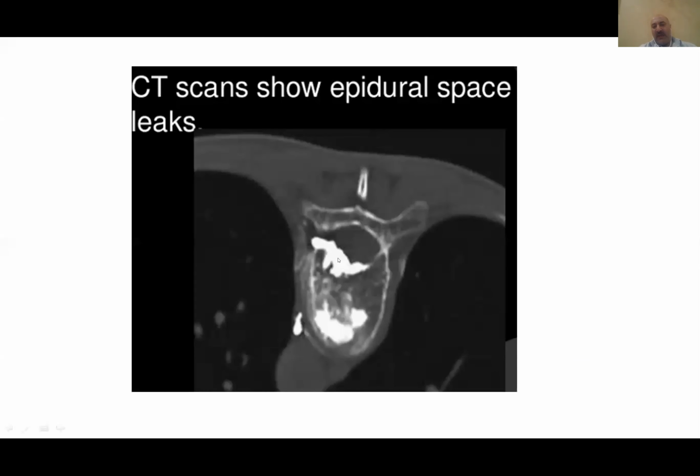As my colleague Khaled mentioned, nowadays, even if there is a fracture in the posterior wall, it's not an absolute contraindication. We can still operate if you follow the instructions, the ones we just mentioned, and my colleagues mentioned. Besides, when you press the cement, don't push it too strongly. Just go gently. Spread the pressure.